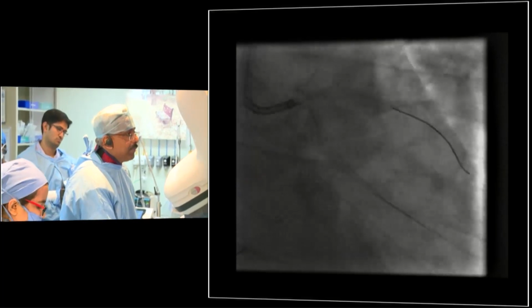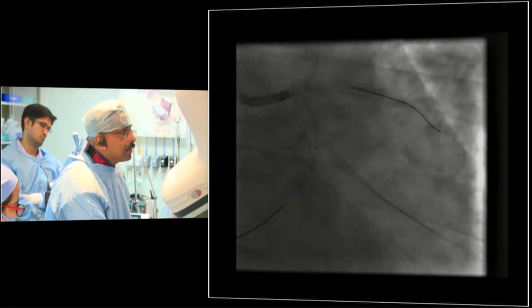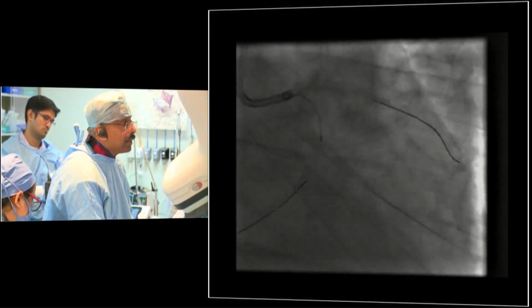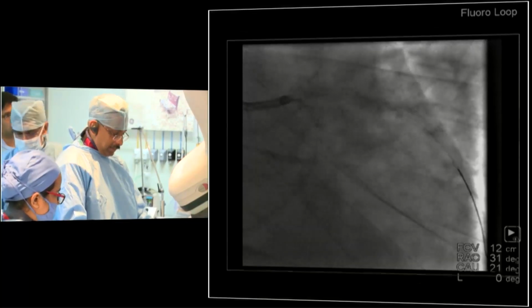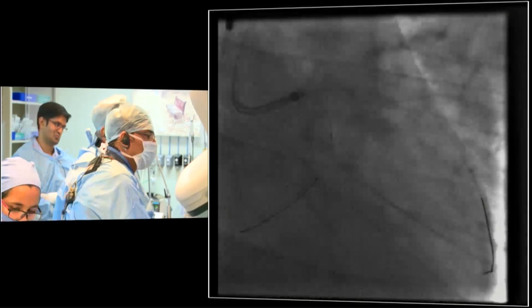So this balloon is a bit bulky and it grabs on the wire. Having a little bit of difficulty. Can you just pull the balloon back slowly? Or just push and pull. I'll open this.